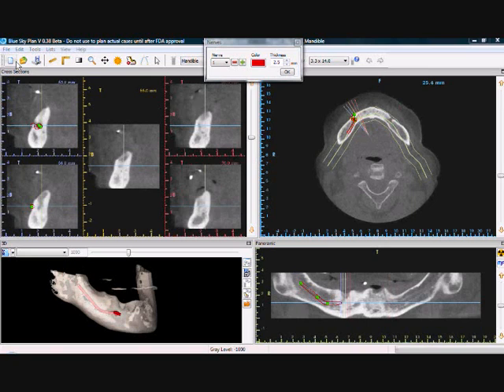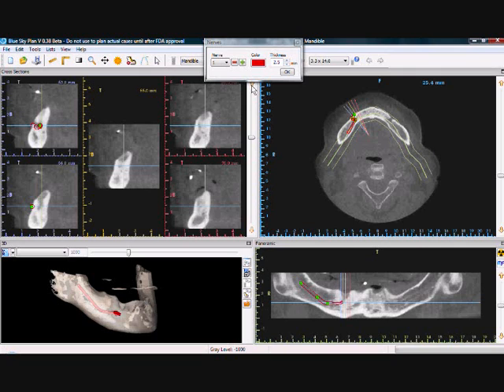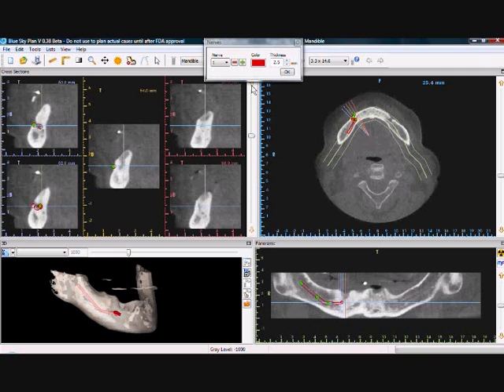A nerve can be drawn and the placement can be edited in the cross-section view as well. The functionality in the cross-section view is the same as in the panoramic view. Moving a green node modifies the nerve placement, and a new nerve can be drawn by clicking on the green plus sign.